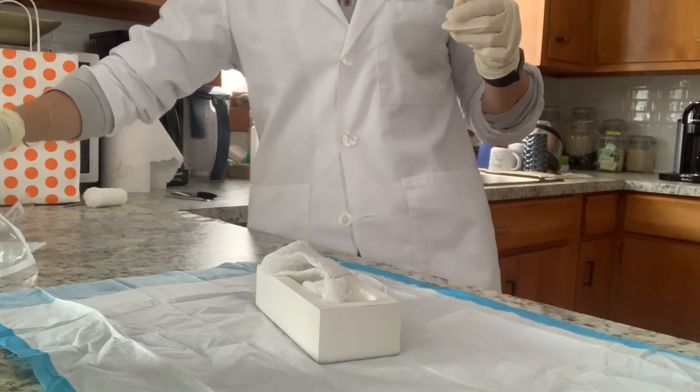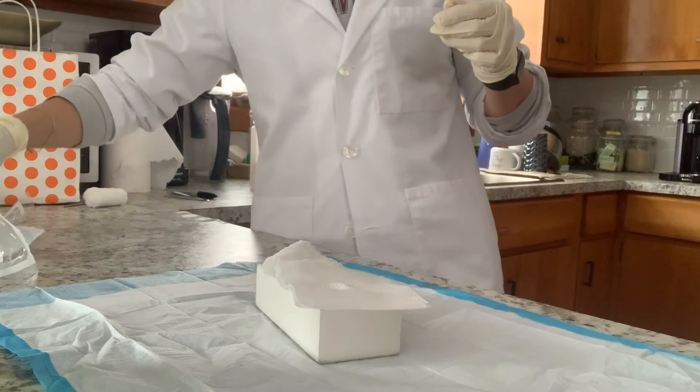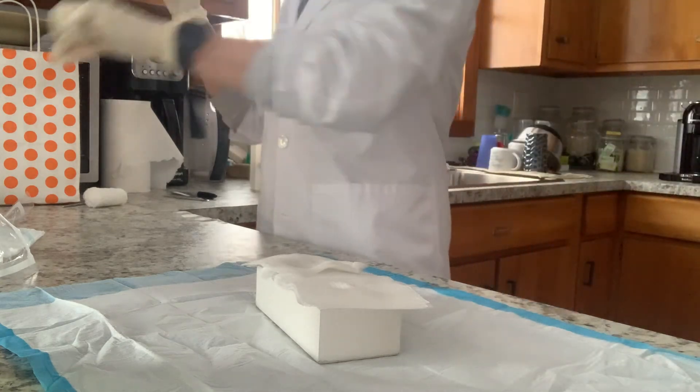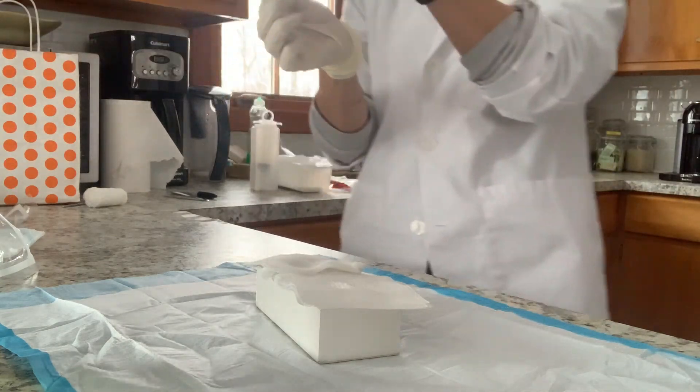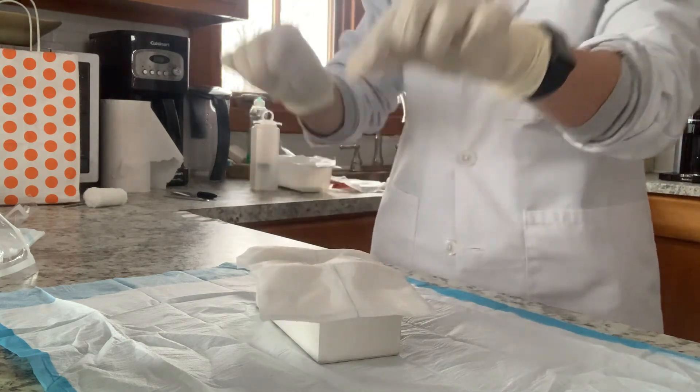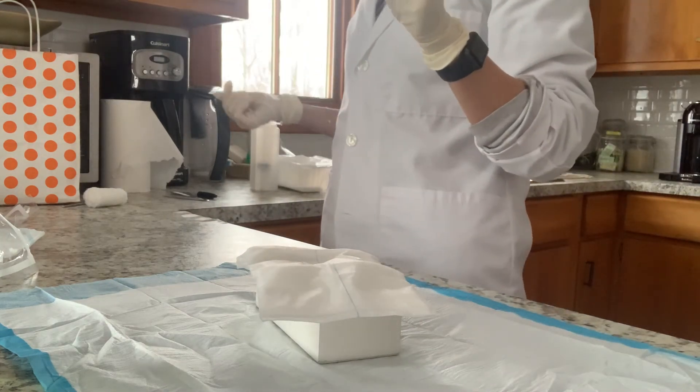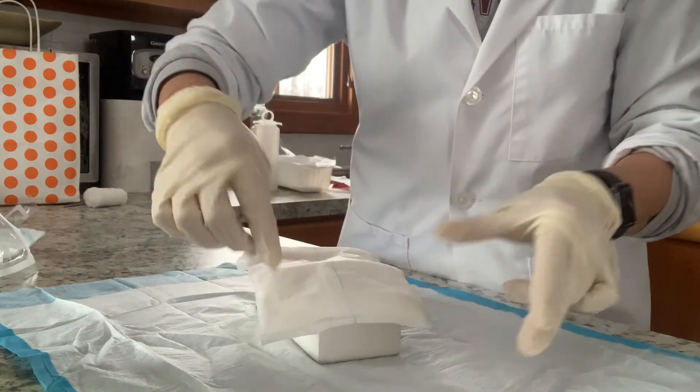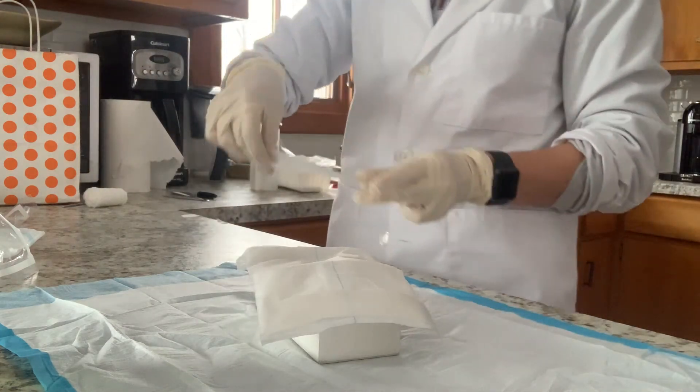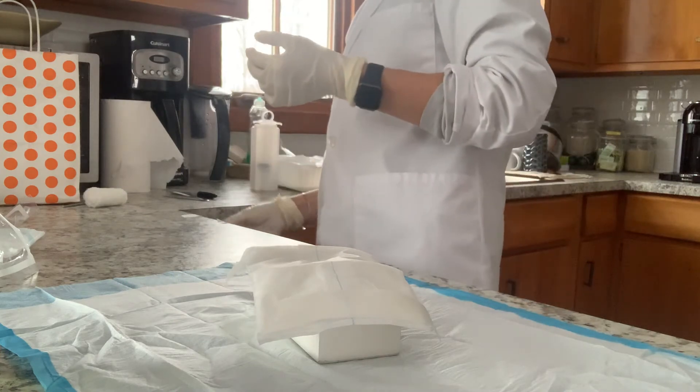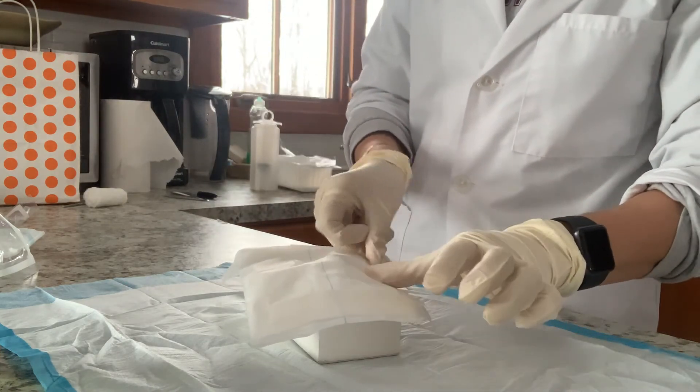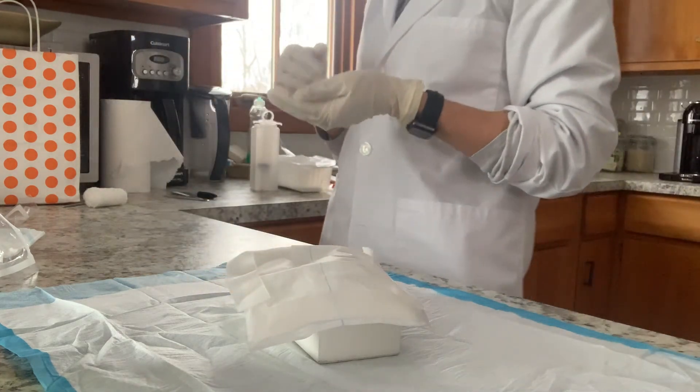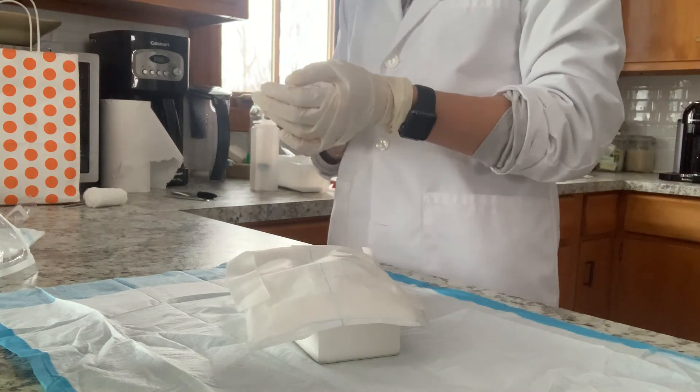And then we're going to take our gauze. One, two, and you try to grab them in the center so you have the most control. And then we're going to take our ABD bandage, place that over top. And then we would now tape the bandage. So at this point you would tape it down to the skin. Obviously if you had some skin and again, it would depend on where you're taping, but you're going to usually do all four sides. And then I would dispose of my sterile gloves.